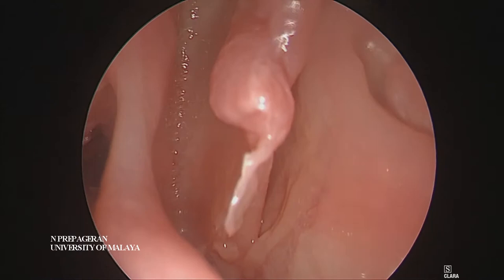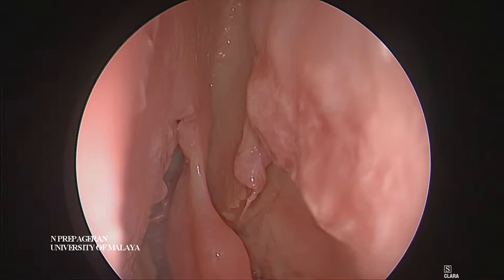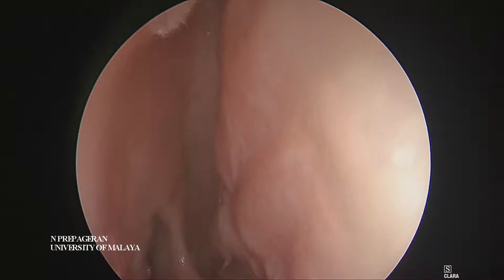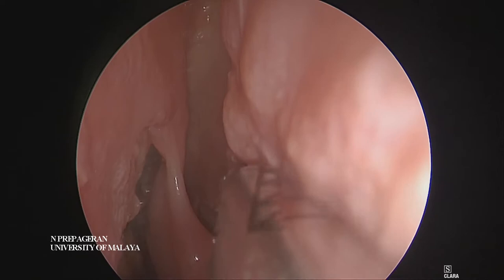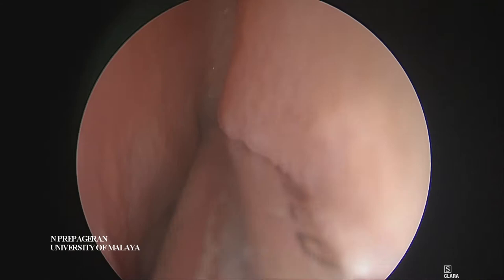I'm going to change my scope to a 30-degree scope. The idea, first of all, is to be able to see the middle turbinate on both sides. So we need to remove enough septum until we are able to identify the middle turbinate on both sides.